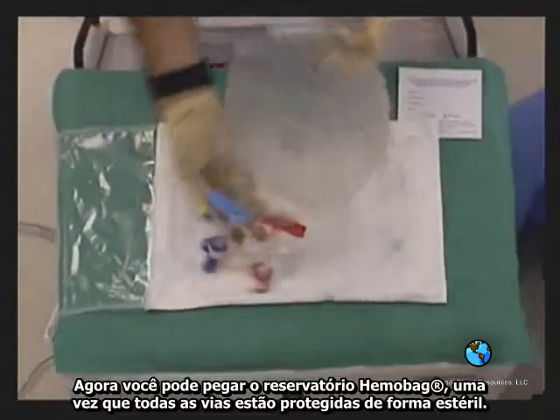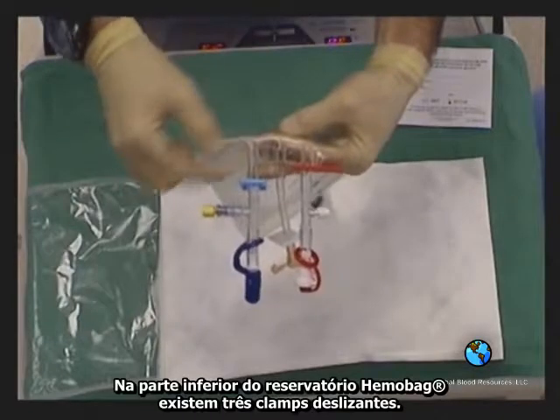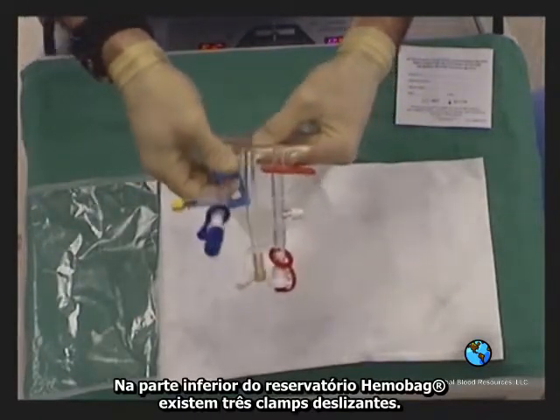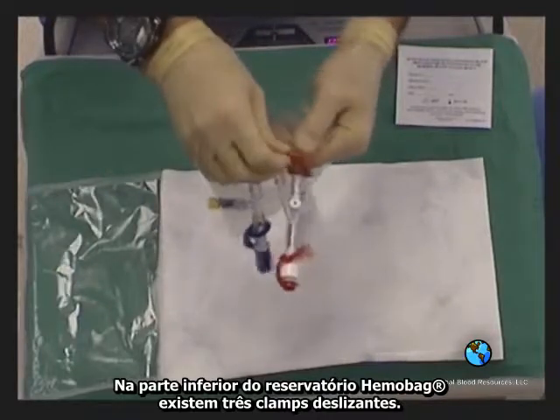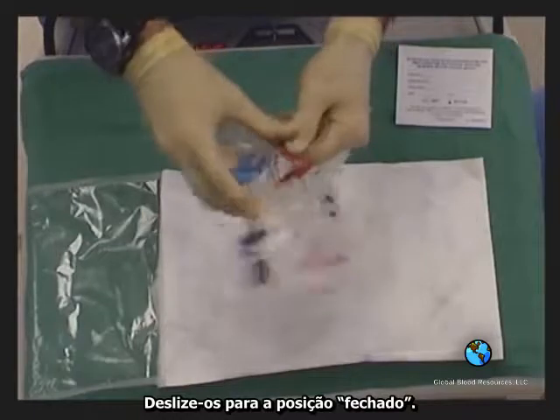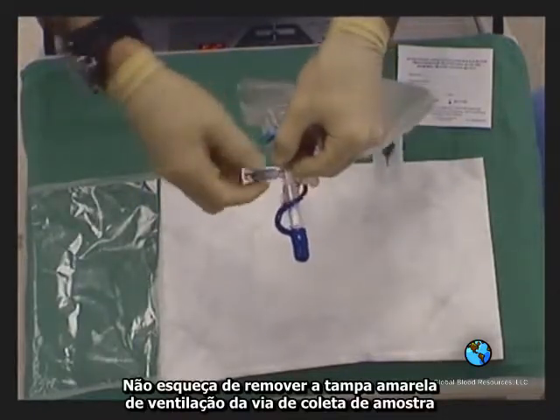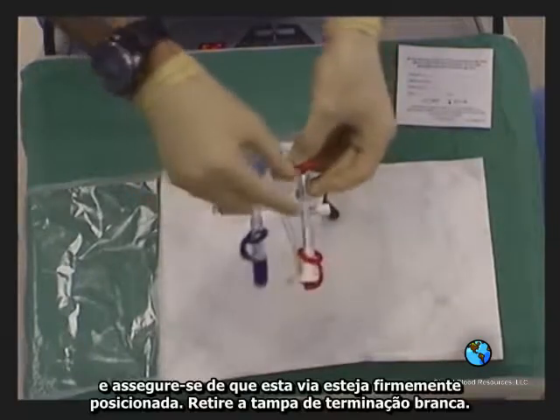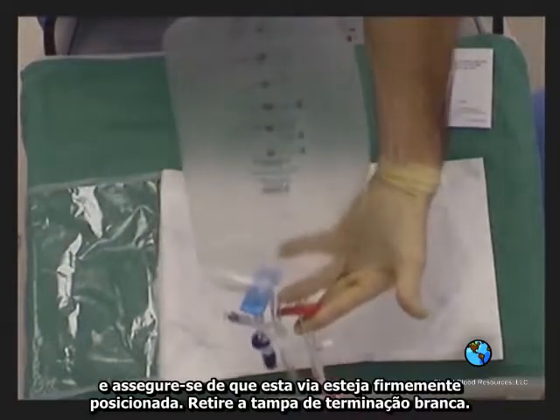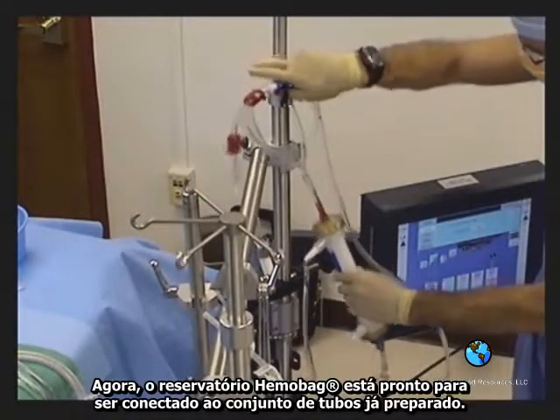Now you can pick up the Hemobag as all ports are sterilely closed off. At the bottom of the Hemobag, there are 3 slide clamps, and they only work in a specific space above the 1/4 inch connector. Slide them all closed. Don't forget to remove the vented yellow cap from the needleless sampling port and make sure it's tightened down securely, as well as the white luered dead end cap. Now the Hemobag is ready to connect to the primed tubing set.